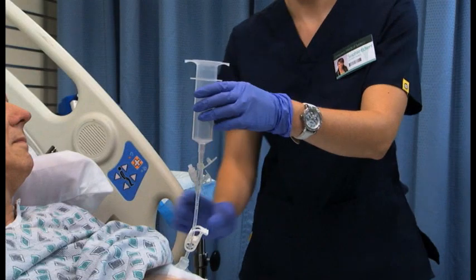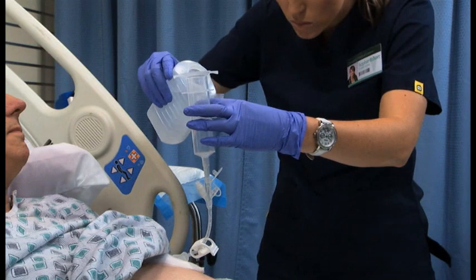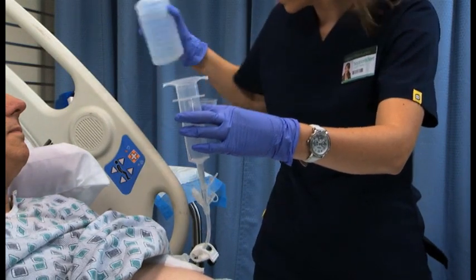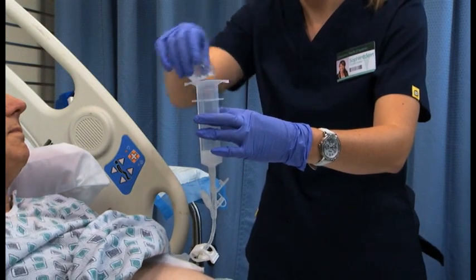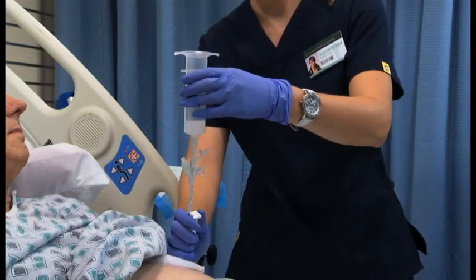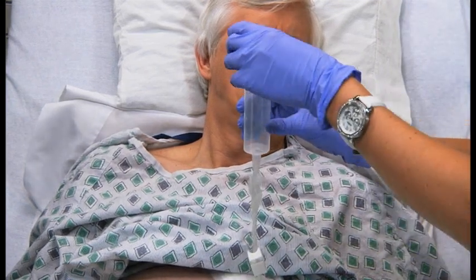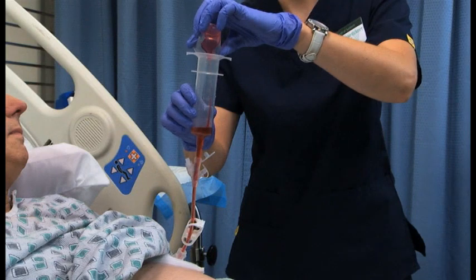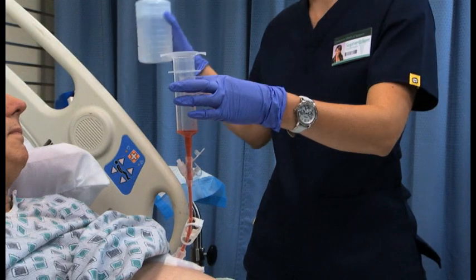Since you are giving more than one medication, follow this medication with a 5 to 10 milliliter water flush before you give the next drug. So pour 10 milliliters in the cup that the furosemide was in and pour that into the syringe. This will rinse the cup and provide your flush. Okay, I unclamp the tube and flush the tube with the 10 milliliters of water. Now, pour guaifenesin into the syringe, pour a little water into the cup to rinse, and administer to the patient.